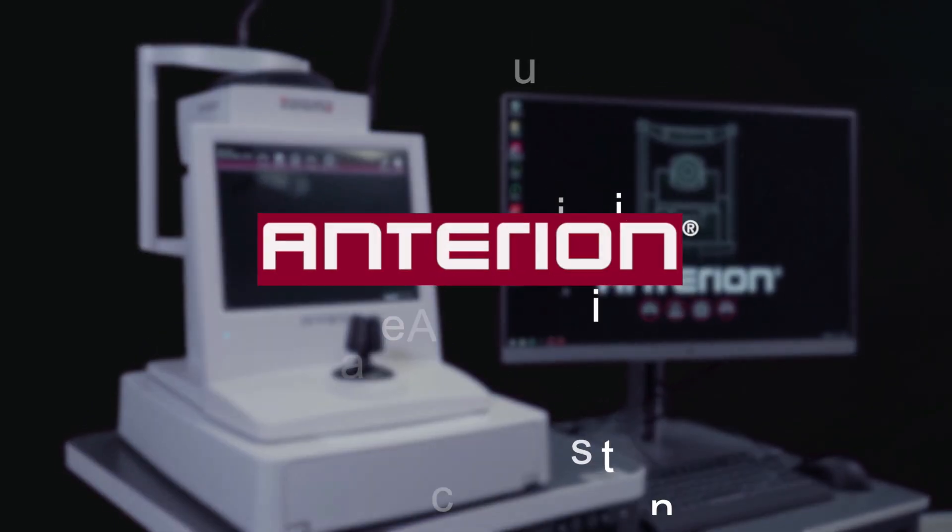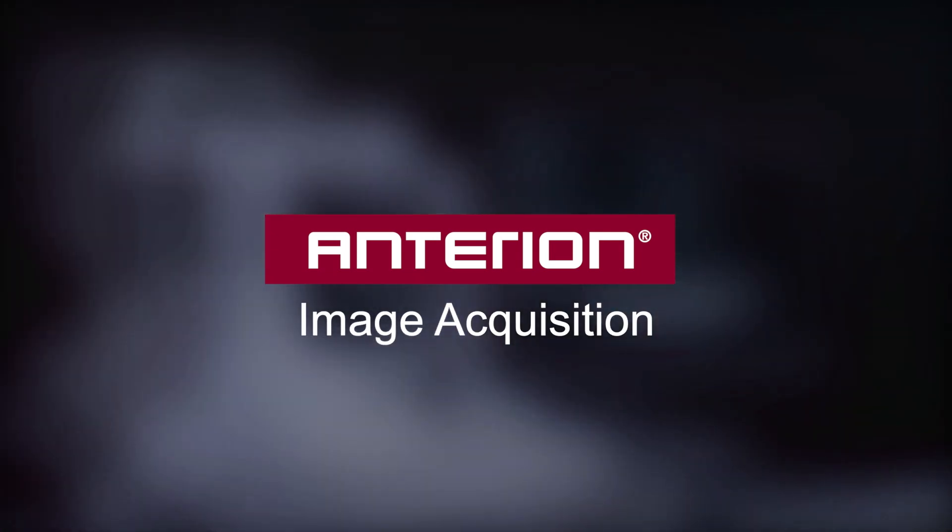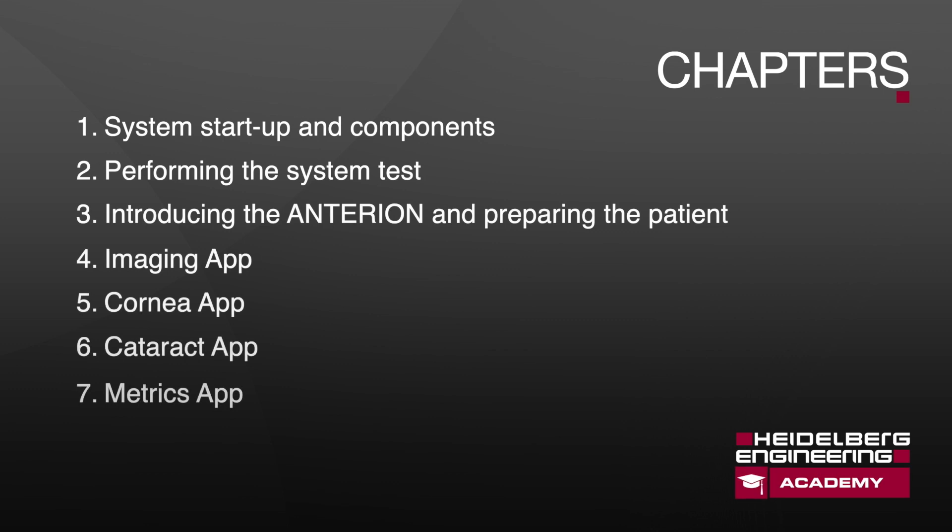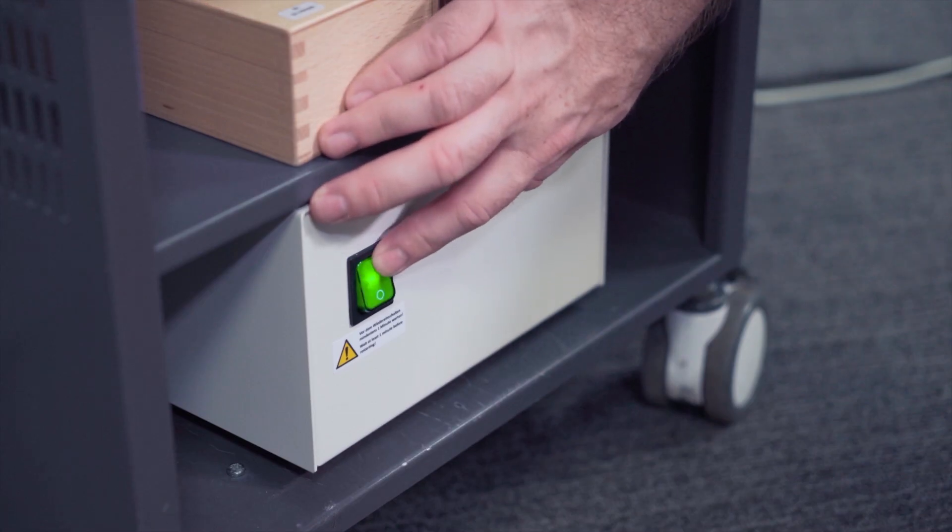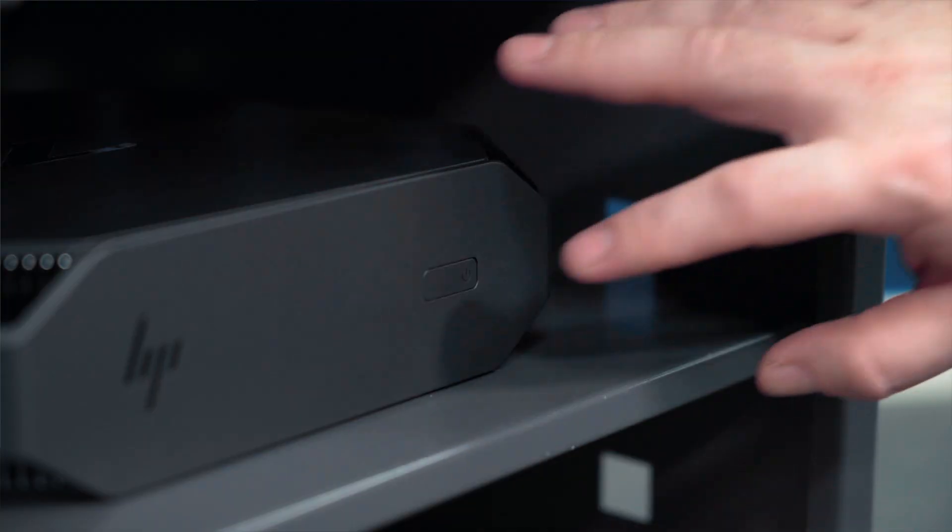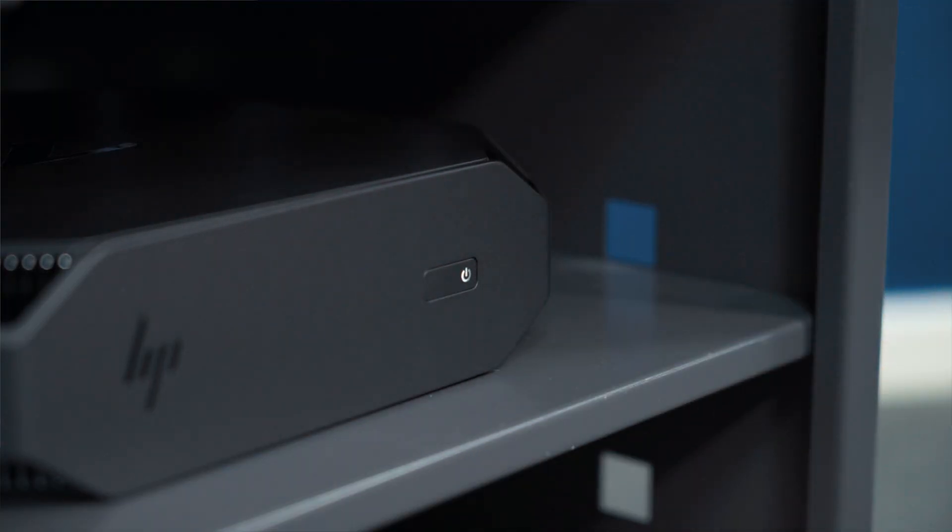This is a short instructional video for how to take images with the Anterion. To switch on the device, we start with the isolation transformer, the PC, and finally the base of the unit.